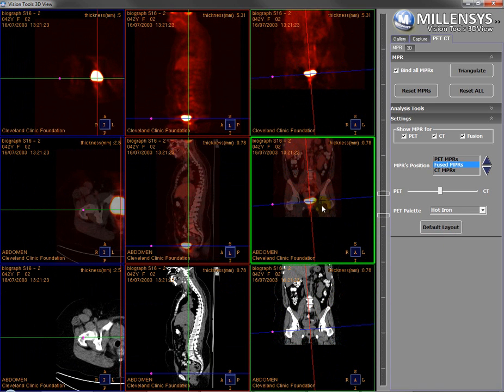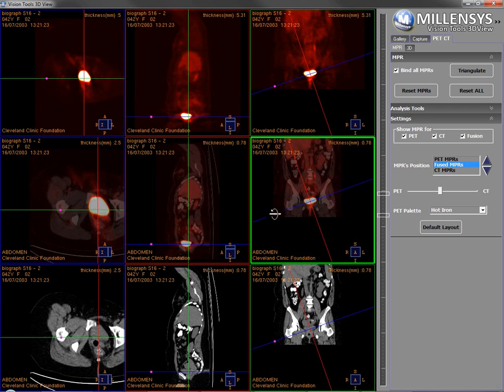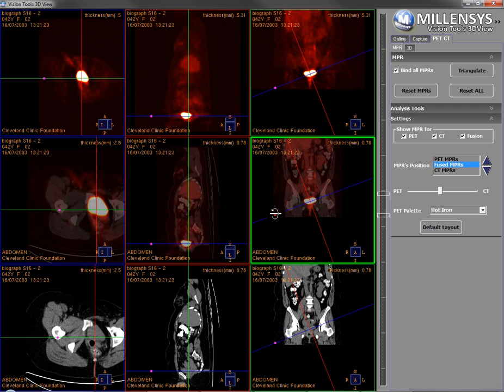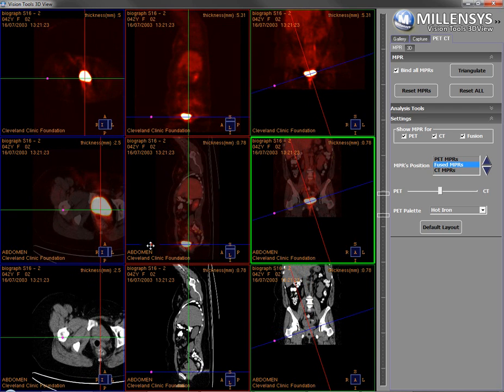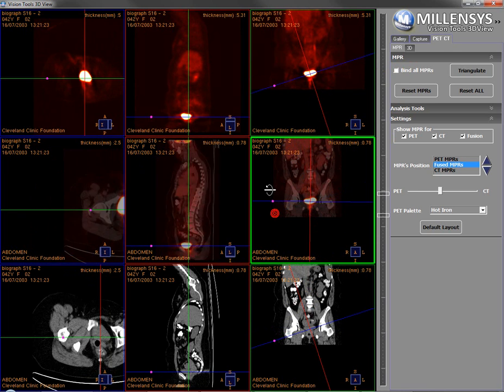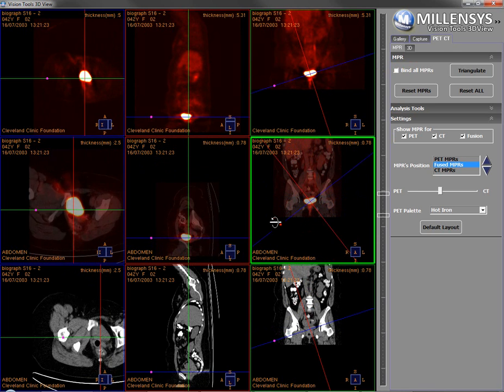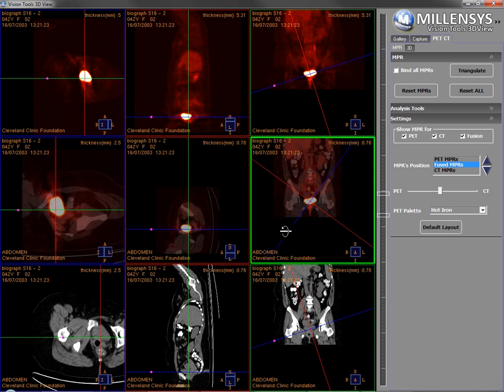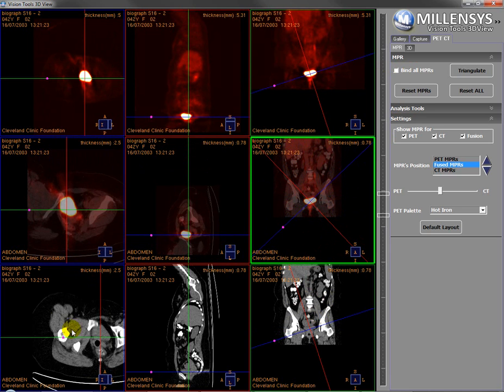Suppose I want to turn off this binding of the MPRs — I want to rotate on the fused region only. I disable the bind MPR tool, so I can move the fused MPRs only and leave the others. At any time, I can reset the MPRs or I can reset all.